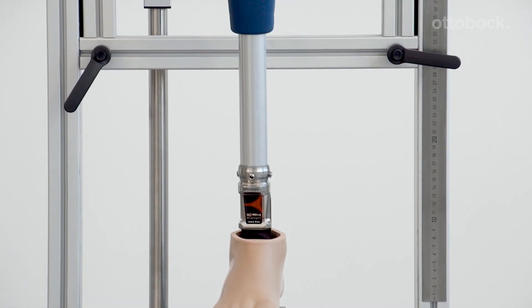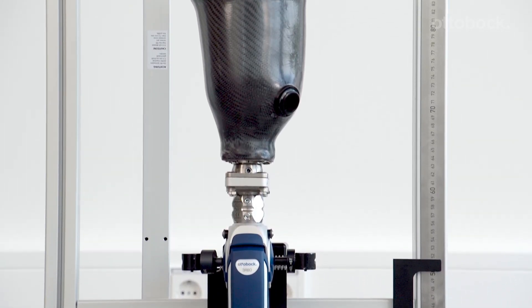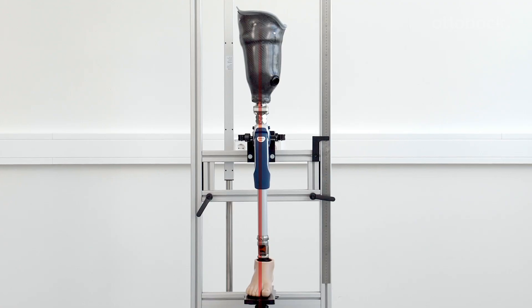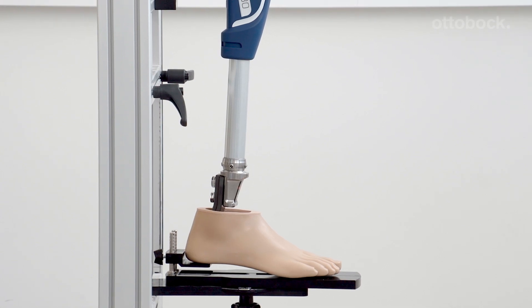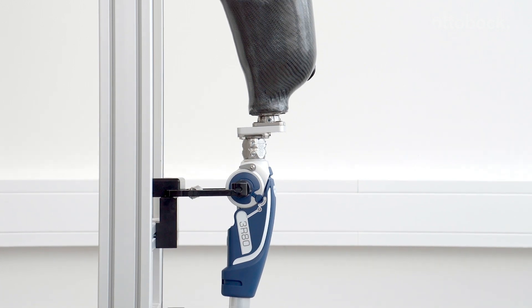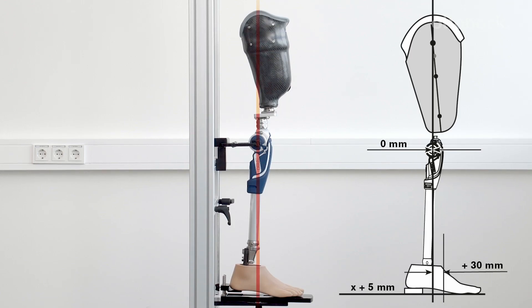The alignment and adjustments are easily completed in the following steps: bench alignment, static alignment, and dynamic trial fitting. For the correct bench alignment values, please refer to the displayed table.